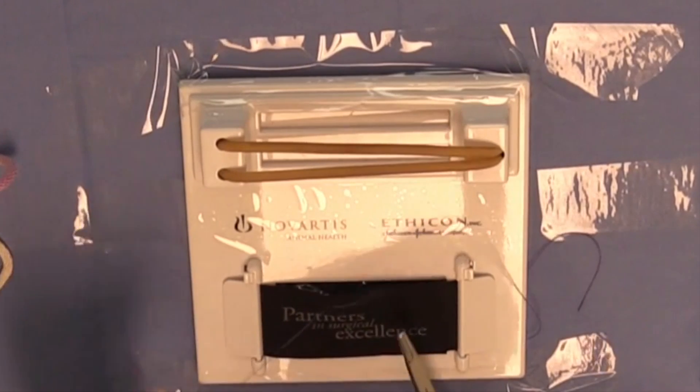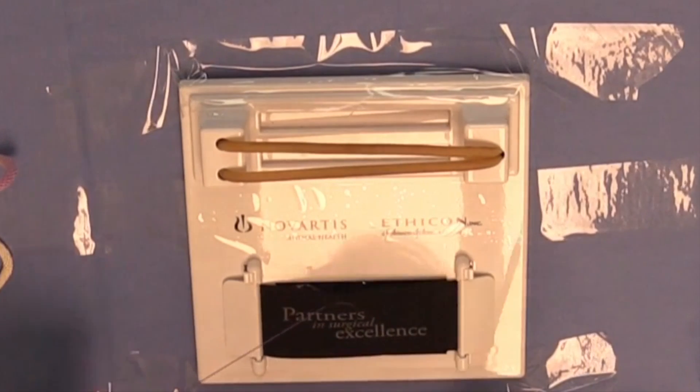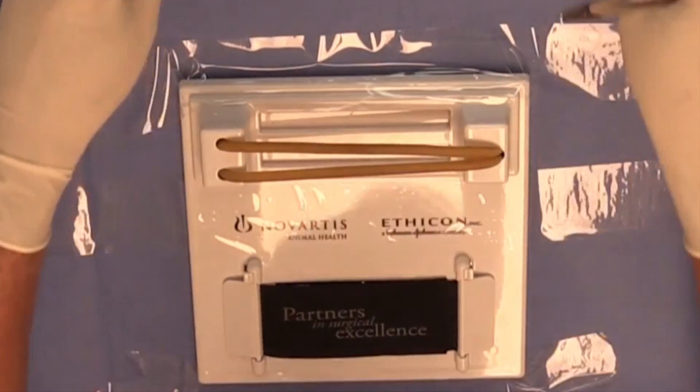So you have two places to practice actual suturing techniques: here on the Knot Board, or on your DAISY, as we'll demonstrate in just a little bit.